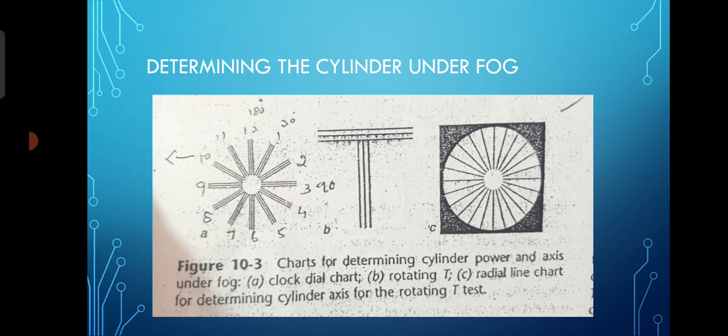Let me discuss the clock dial. This is a clock dial chart — you can see there are 12 radial lines, each looks like a wall clock. Each line position consists of three lines: one middle one and two outer ones. This chart is placed in front of the patient when the patient reads 6/12 or 6/9 partial. You ask which of the radial lines seems clearer to his eyes.